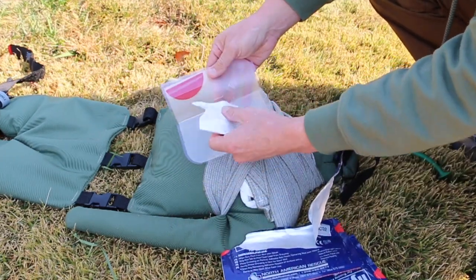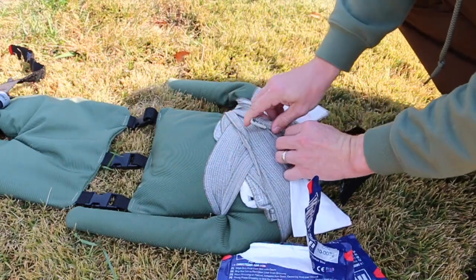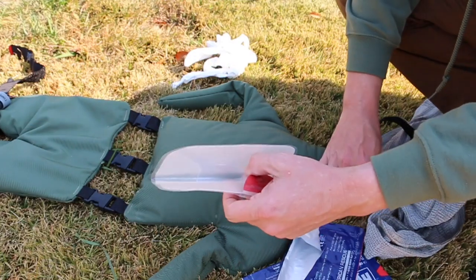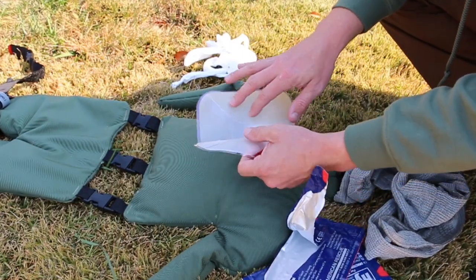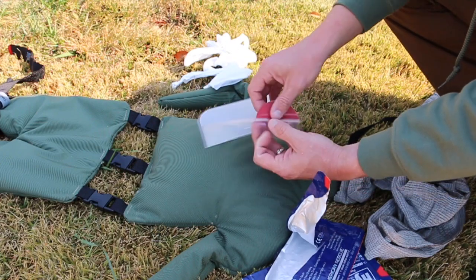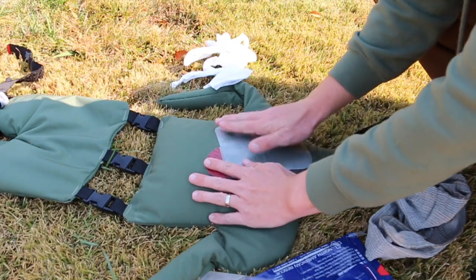It does come with a little bit of a 4x4 here. That way if you need to wipe off the chest area, you can wipe it off. Let me undo this. There's really bandage real quick. All right, so we're going to say we have an injury to the chest here. Then we use that 4x4. If you had to wipe a little bit of blood away, I've found that you really don't need to. This is going to stick through blood, hair, things like that. It just has the channels here that are going to help air and blood release from the thoracic cavity to vent. So you pull the red tab. These are super sticky and stick on, okay?